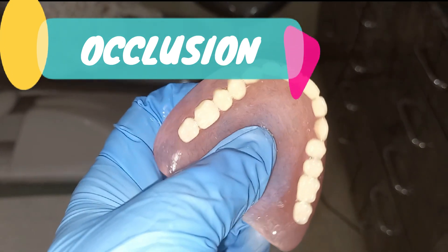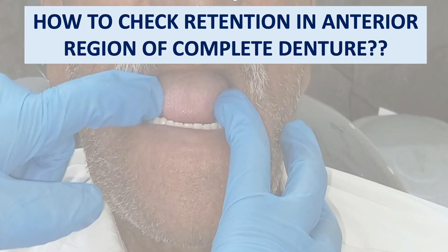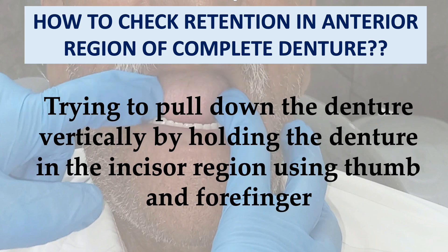Now we will deal with retention. To check retention in the anterior region of the maxillary complete denture, try to pull down the denture vertically by holding it in the incisor region using your thumb and forefinger.